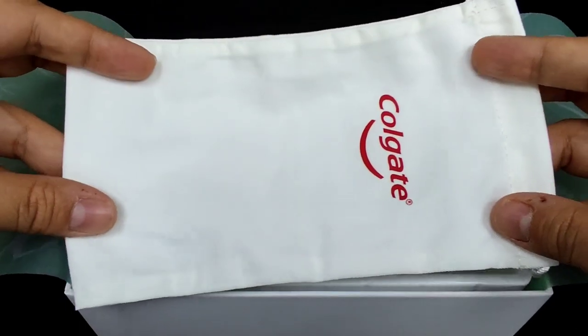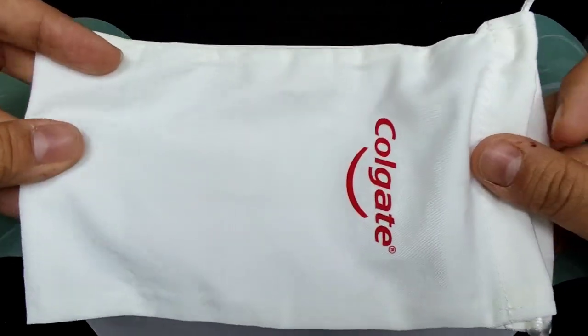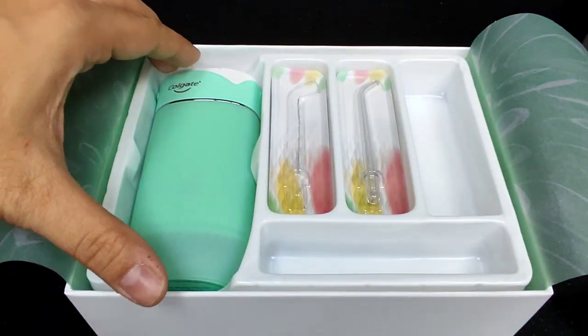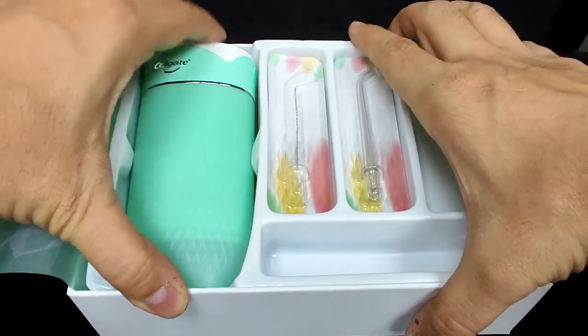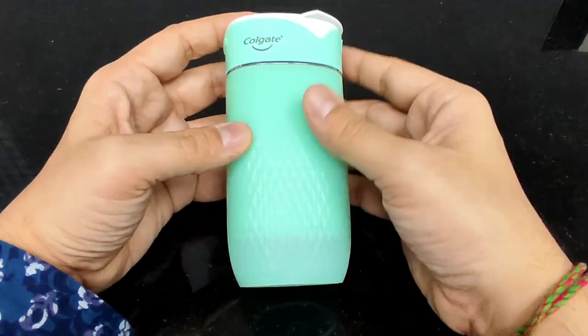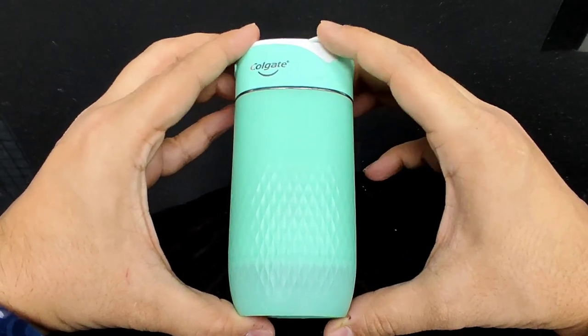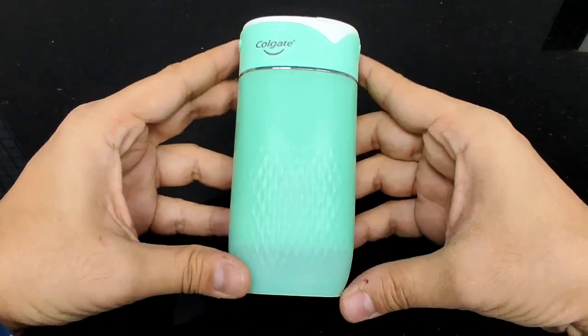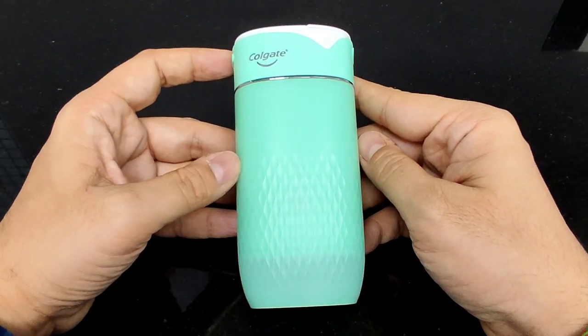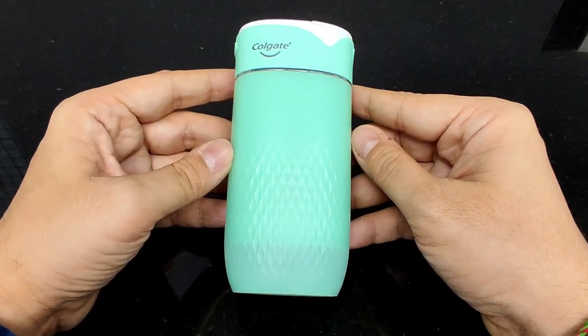In case you're someone who's traveling and on the go, this is something you can very easily and conveniently carry with you, because the biggest advantage of this water flosser is its convenient size. It's quite compact — smaller than my palm — which means I can easily store it at home or keep it in my travel pouch when moving from city to city, country to country.